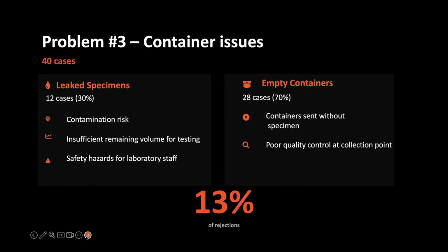So the next issue is one that involves specimen containers. Some arrive leaking, others arrive completely empty, and this could be completely prevented by taking more care when you're requesting and making sure that before you send to the lab, the sample has actually been collected, or like on the next slide, Jeremy.